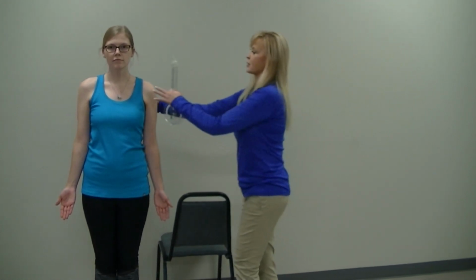Shoulder abduction can be measured with the client seated, standing, or in supine. This video will discuss the standing and seated techniques. When performing the measurement, be sure the individual is standing upright with their shoulder girdle in neutral. A forward rounded posture impedes the motion. There is a higher risk for substitution patterns to occur in standing.